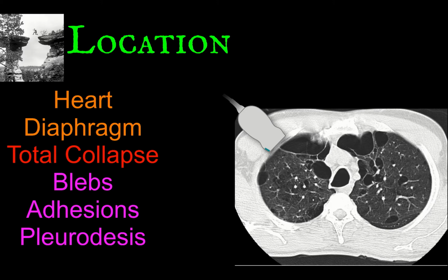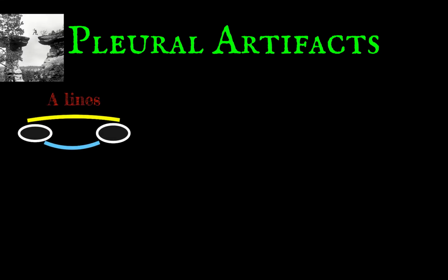However, there are also some lung artifacts that you need to know about which can also tell you if the pleura are touching, and more importantly, can tell you if the lung parenchyma is too dense with fluid and inflammation, which suggests that you can harm your patient by giving too much fluid too fast. The first artifact you'll often see produces horizontal lines called A-lines. This is essentially a reverberation artifact.